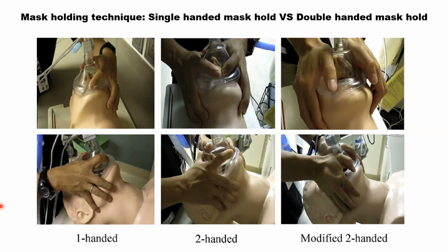Then we have the double-hand technique, in which we need another person helping us. Then the same technique, just doing it with both hands.